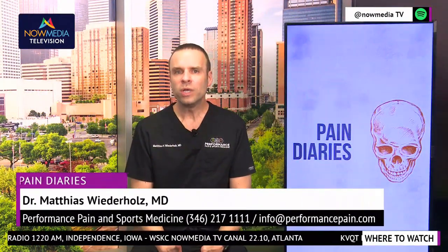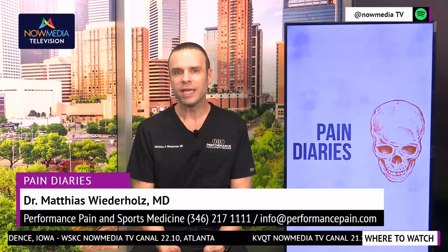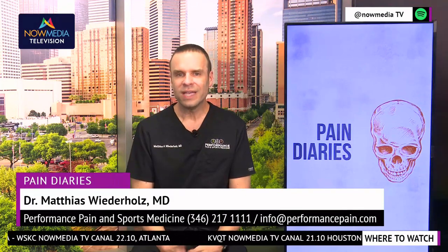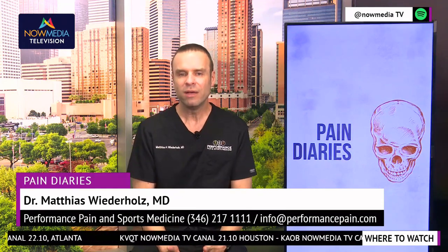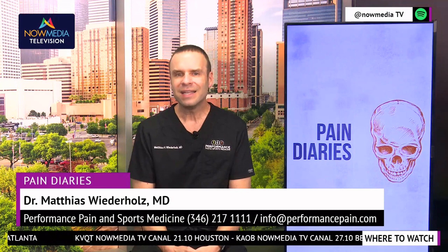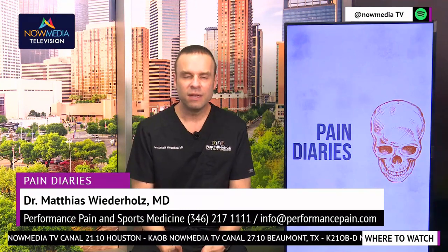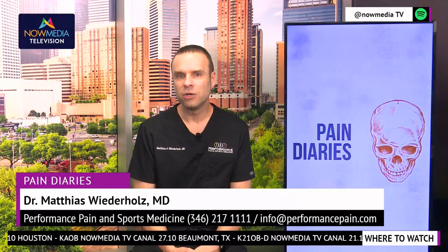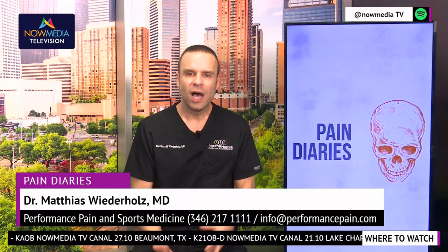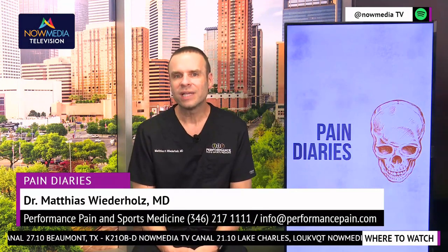Now, there is always a risk when you're placing a needle in the epidural space of the spine. It's possible that you have a spinal headache. This is when fluid leaks from the spinal canal. That is easily treated. It's possible that you develop an infection. One of the reasons we choose Medtronic stimulators is because they have another aspect to their portfolio called the TYRX envelope.